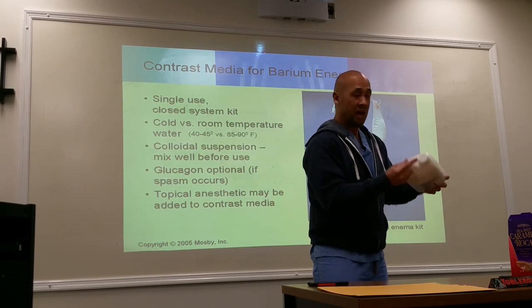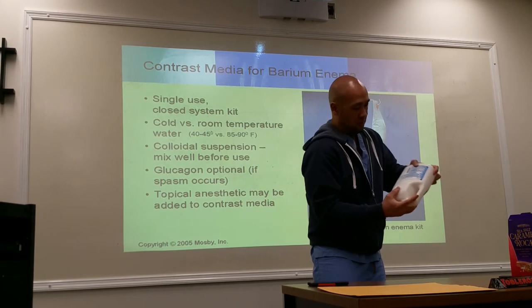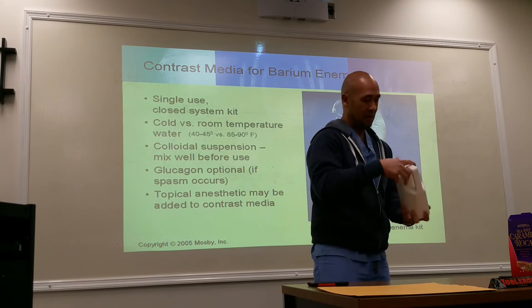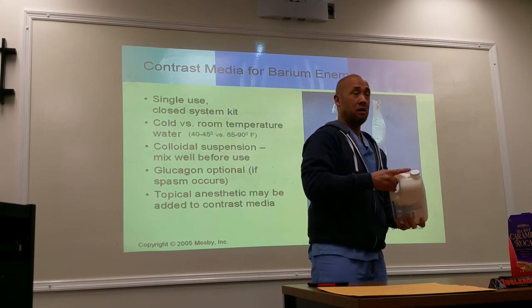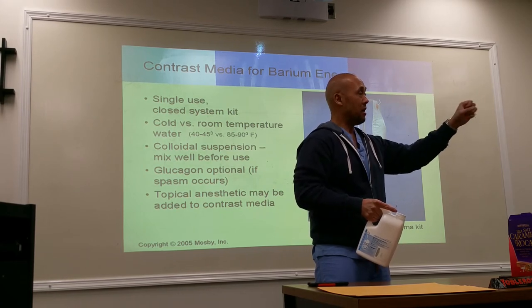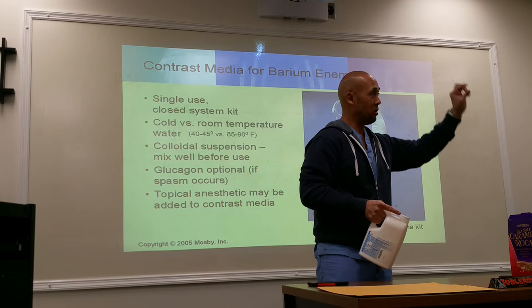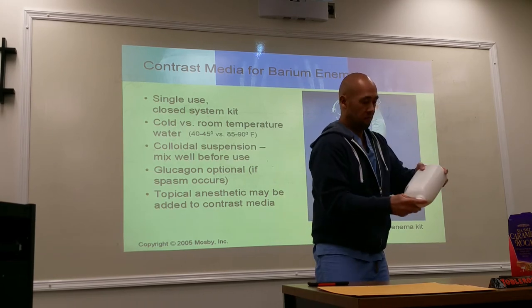So one of the things that you have to do before you start putting the barium in the patient's bowel is shake up the bag before you allow the barium to go in. Because if you're waiting to start the procedure, the barium may settle to the bottom, and it's not a good mix.